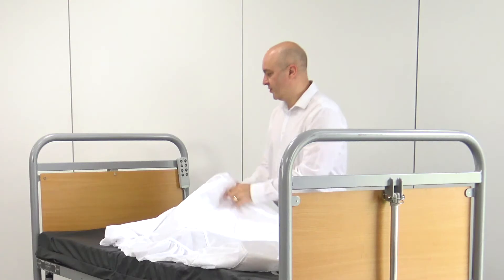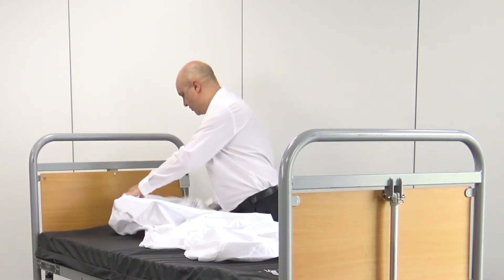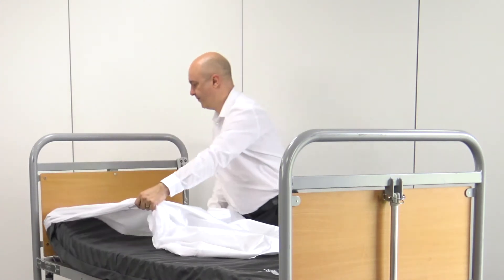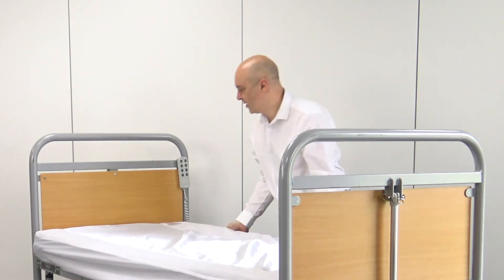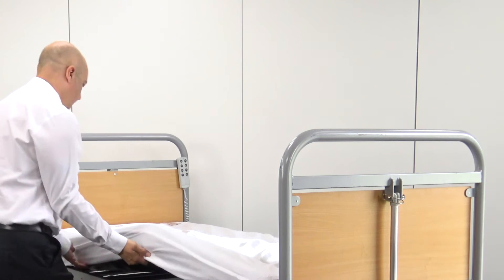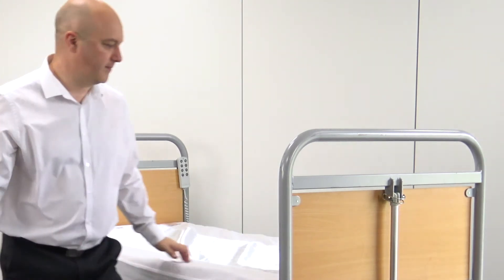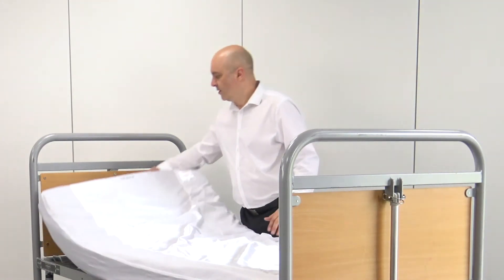I'll fit the bed sheet on the base by just hooking it around the corners like so. The elastic will hold all that in place. There is a label on the top of the bed that says 'this side up', so that goes to the head end, not the foot end.